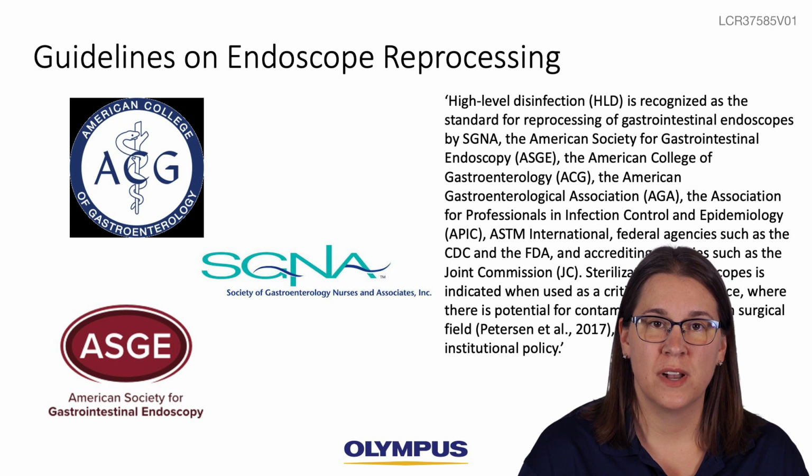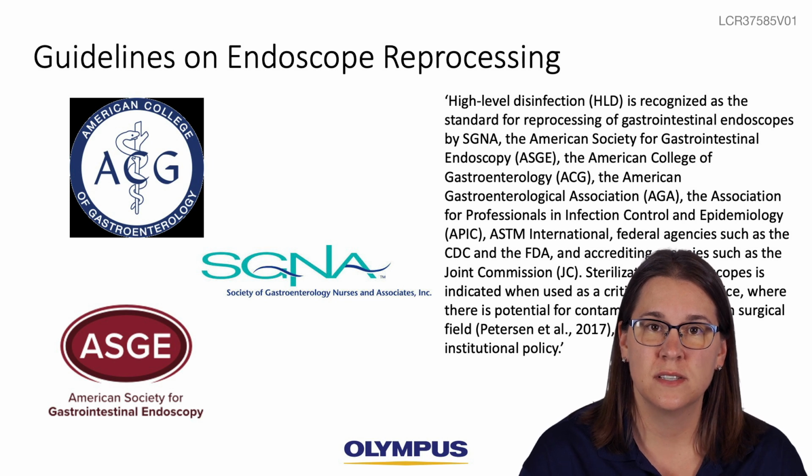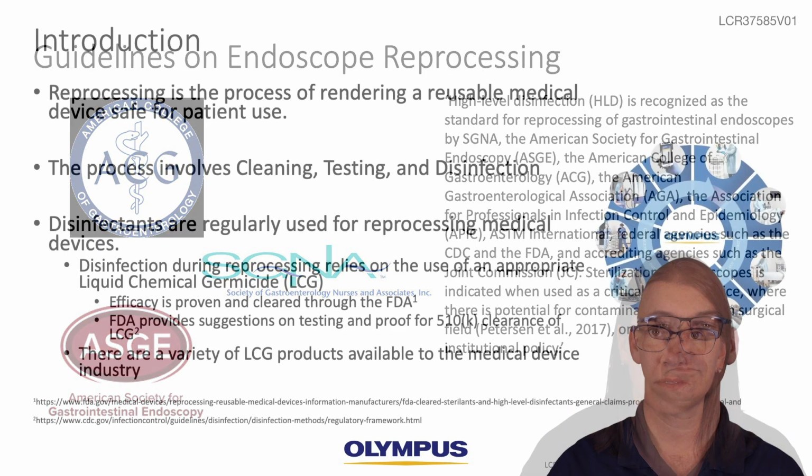As we talk about reprocessing training and resources, I want to move into the efficacy and safety of reprocessing duodenoscopes. This includes the efficacy of the solutions used to reprocess duodenoscopes and the impact these solutions may have on the environment. For this, I want to bring in Jeff Daniels, our Director of Marketing for our infection prevention products.